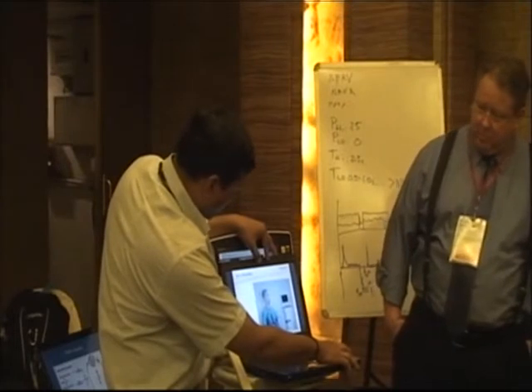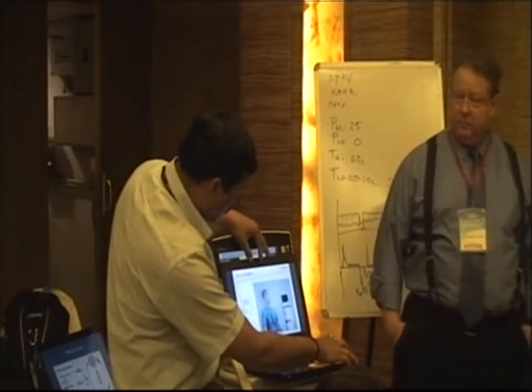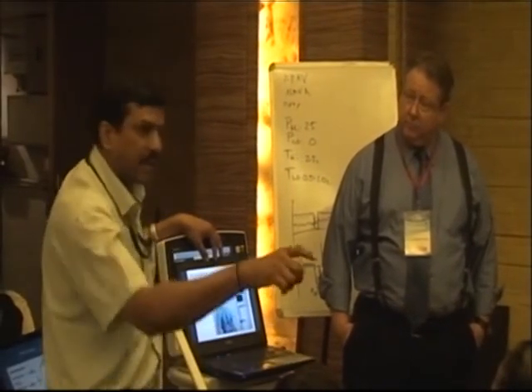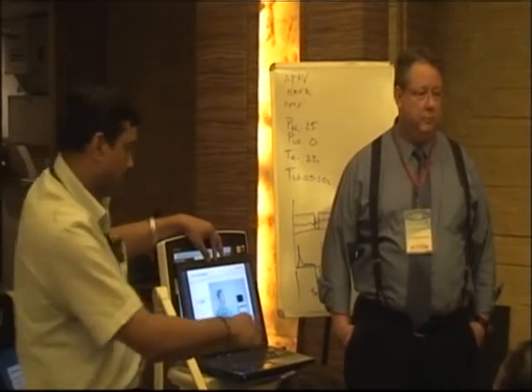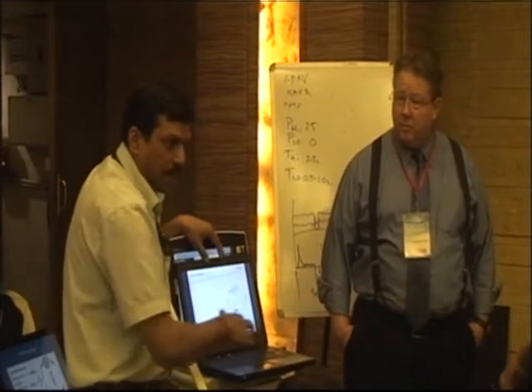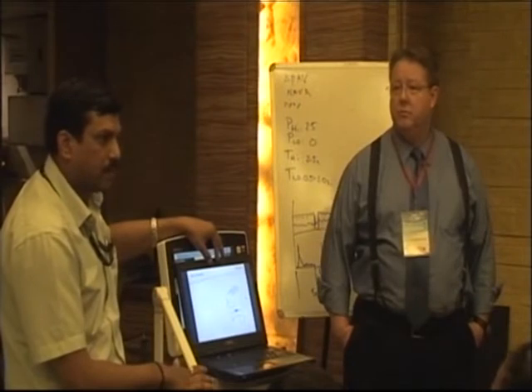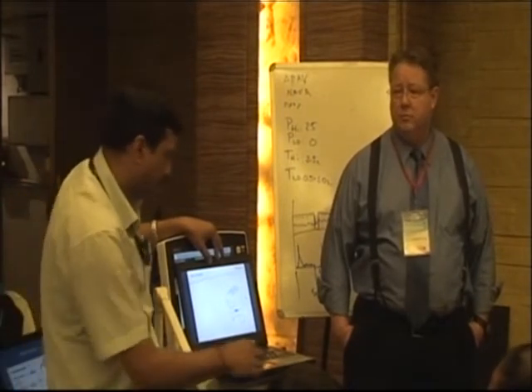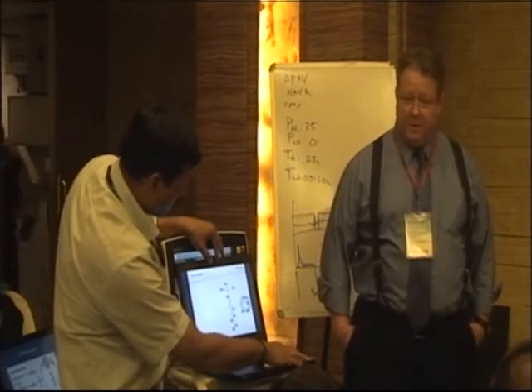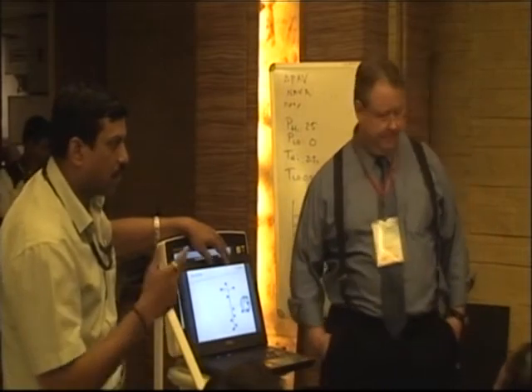So this is the NAVA catheter. For this we require software as well as hardware, this connecting cable and the EDI catheter. These are the catheters we have. We have different installations all over India. The biggest is AIIMS in Delhi. They are continuously using this catheter. It's still relatively experimental and it's super expensive. This is the lumen. It can be used as a feeding tube also, so you don't require an additional tube.